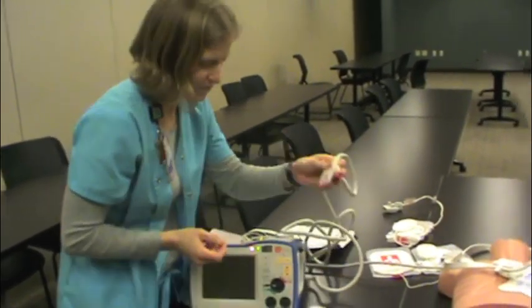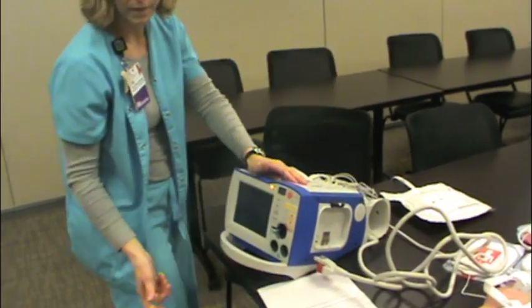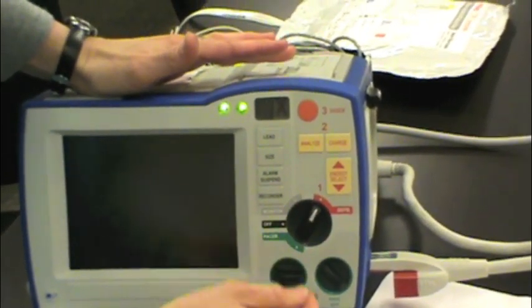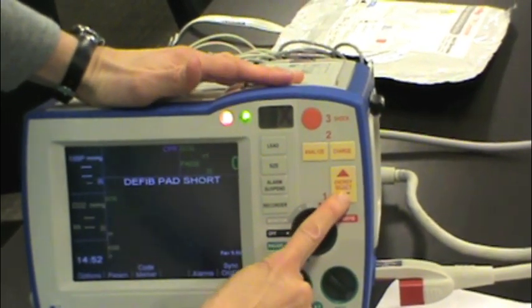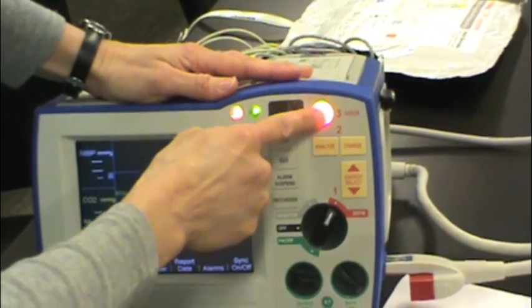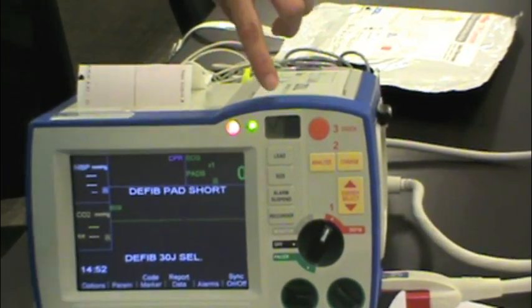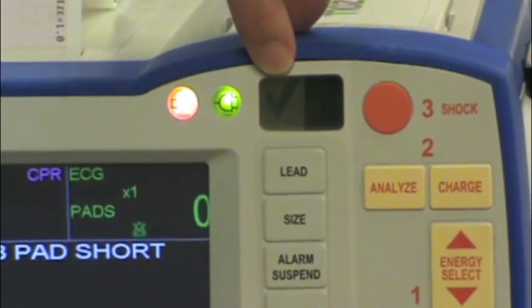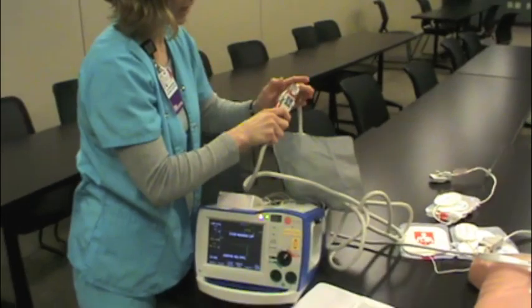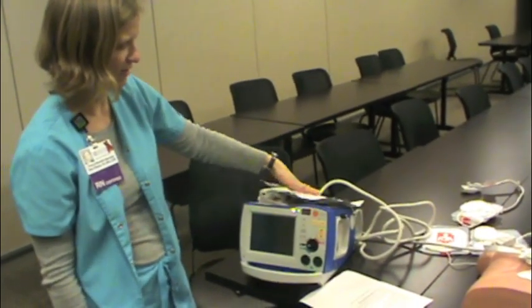So if that ever happens to you, this is how you get rid of it. You take this therapy cable and plug it right here into the side of the machine and deliver that 30-joule charge right into the machine itself. You'll turn this to defib, select the energy down to 30 joules, charge, and just shock it right into the machine itself. Now you can see that the red X has been replaced with a green check. It should always be at resting state plugged into the pads so when you need it, you don't have to fumble with that cord — you can just open the pads and get started.